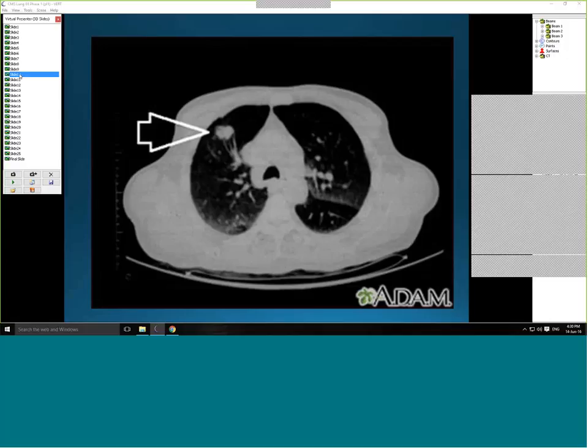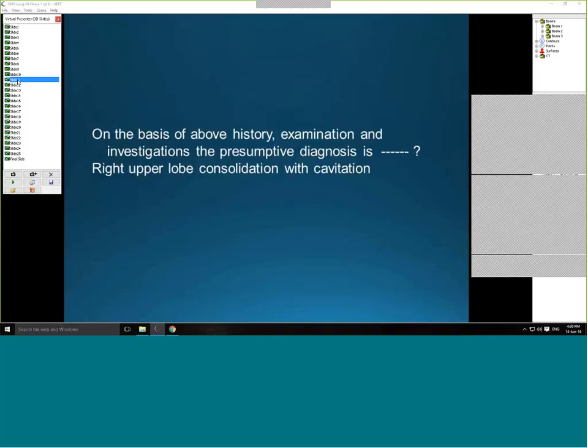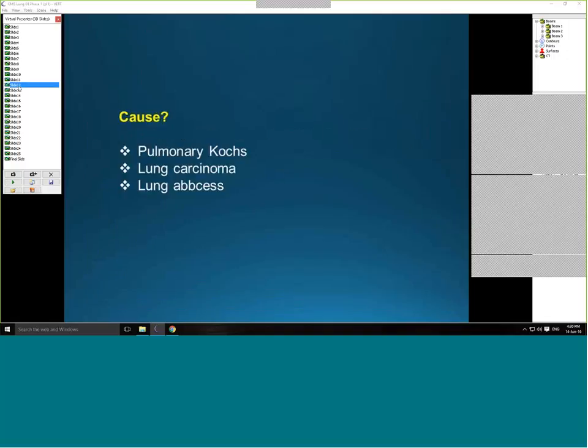This slide here is just a picture of the Vert. This is a picture of our lung cancer, the IMRT, of which Tom was able to take all the plan off, so we were able to have our students plan it on this patient themselves. So the students are then asked what they think the diagnosis could be. And what we do is give them 3 examples. Here we have pulmonary TB, lung carcinoma, or lung abscess.